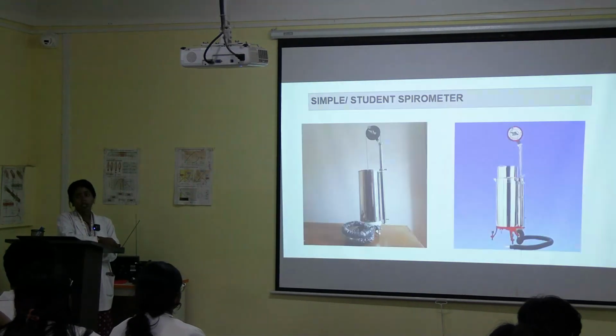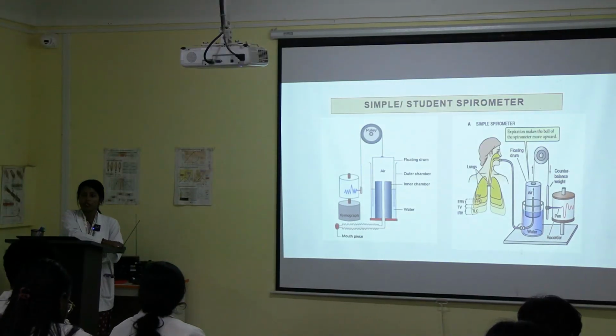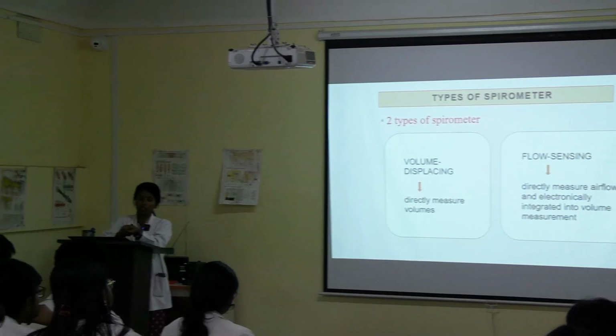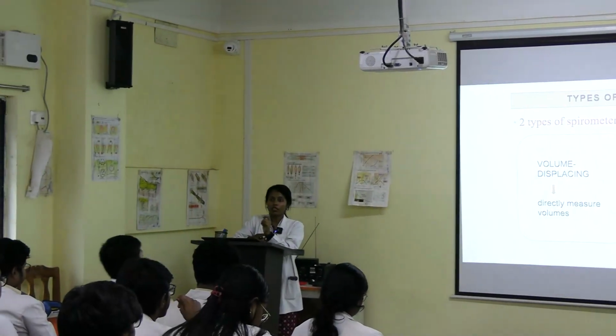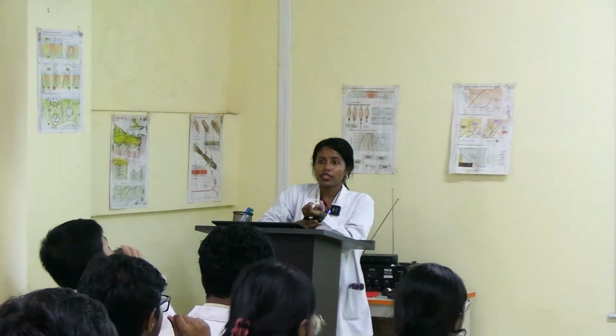So you understood, right? What are the PFT or lung function tests? These are basically a group of non-invasive tests. Here you can find out the static lung volumes and dynamic lung volumes. You have to know what the static lung volumes are, what the dynamic lung volumes are, and what the various methods are. Then, what can we not measure by a simple spirometer?